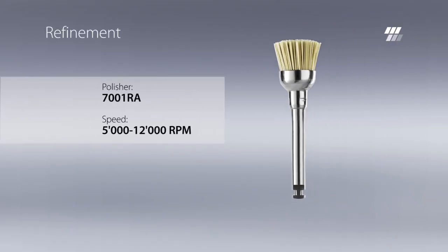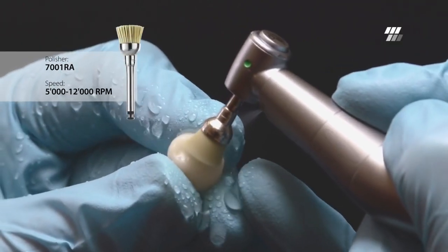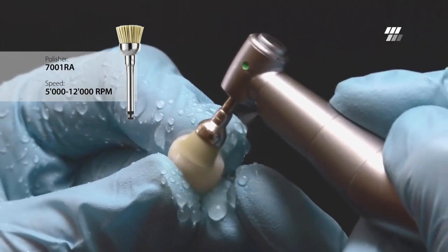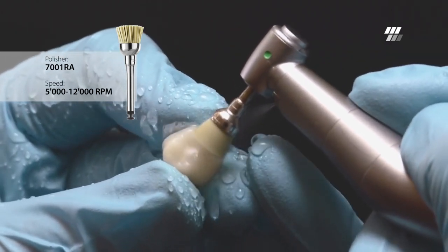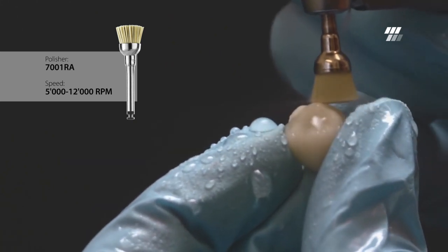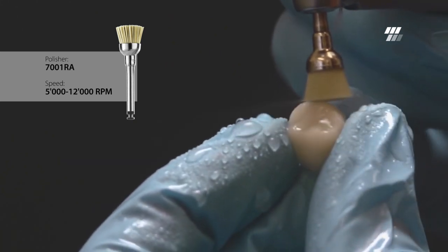For final refinement and a tooth-like enamel gloss, it is recommended to use a Diatek brush. The thin, smooth bristles are coated with fine grit silicon carbide polishing powder. This allows polishing without paste. It is particularly important for this step to exert minimal, constant pressure.